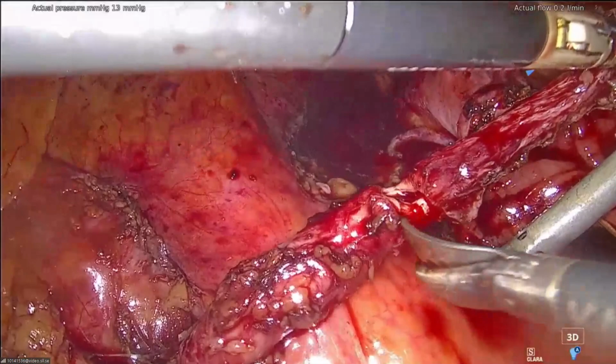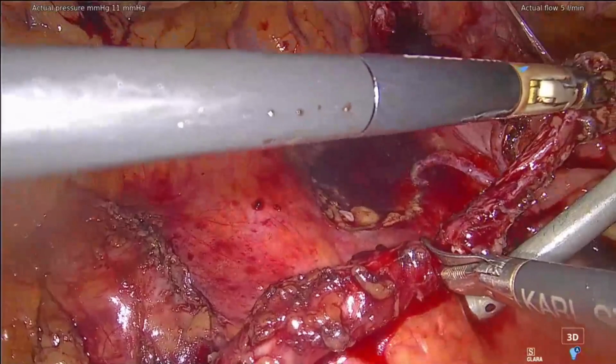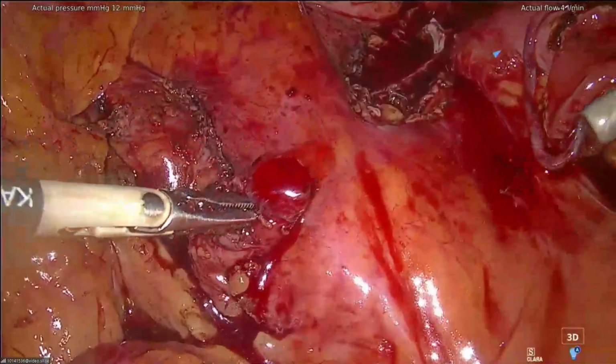That's a very good point. I have just to think about the spatulation direction. Yes, the ureter is alive. And this is for the pathologist, please. You will spatulate on the top. Yes. We have urine and blood, and it's alive. And I have to do a spatulation.